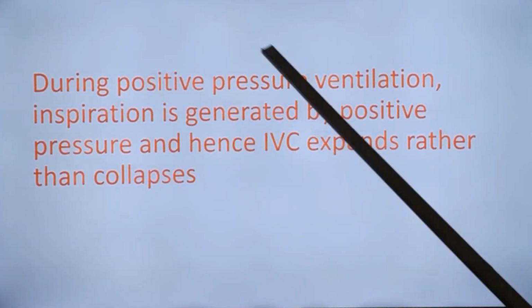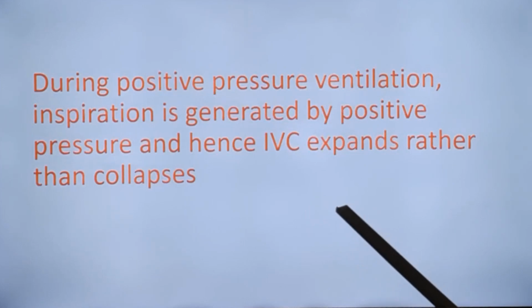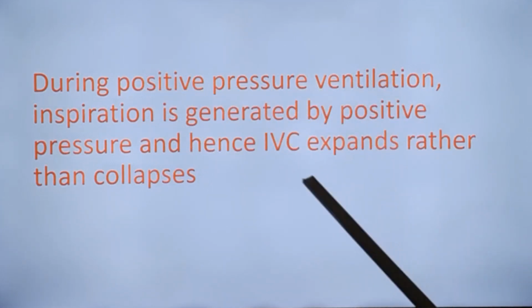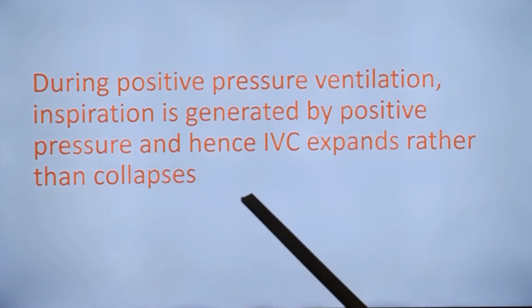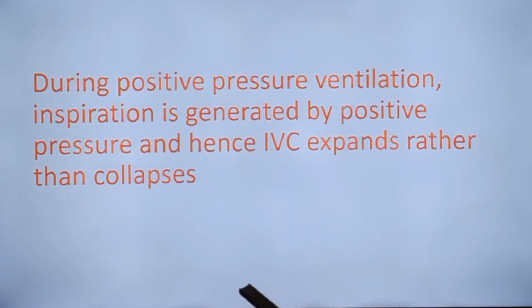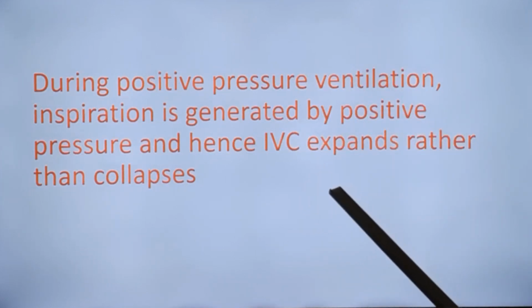This is an important point to be noted regarding IVC dimension in a critically ill person in the ICU. During positive pressure ventilation, inspiration is generated by positive pressure. Hence, IVC expands rather than collapses in inspiration. So, your assessment of IVC plethora may be wrong when you have positive pressure ventilation.